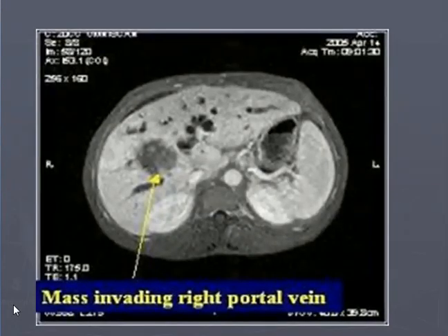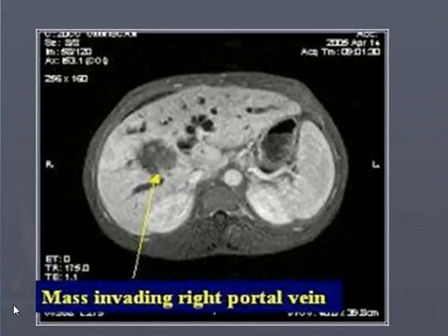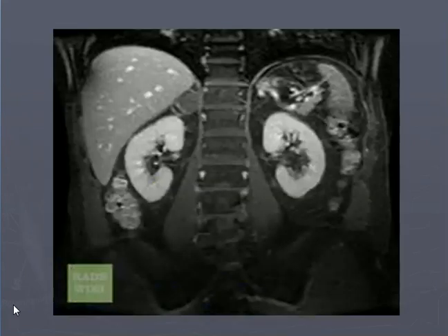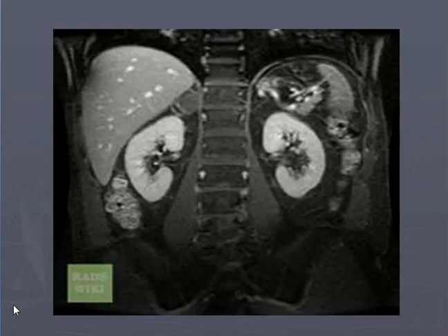Here is one axial image through the abdomen showing liver and spleen on the left side. The arrow shows a mass invading the right portal vein — a hypo or low intensity rounded mass depicted by the long arrow. Another image shows normal tissue differentiation — you can see the liver, kidneys, gut, muscles, vertebral column, and discs. Everything is so clear in this coronal image of the abdomen. You can also see the diaphragms.